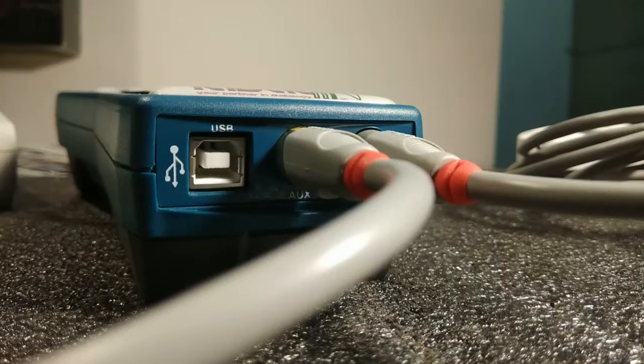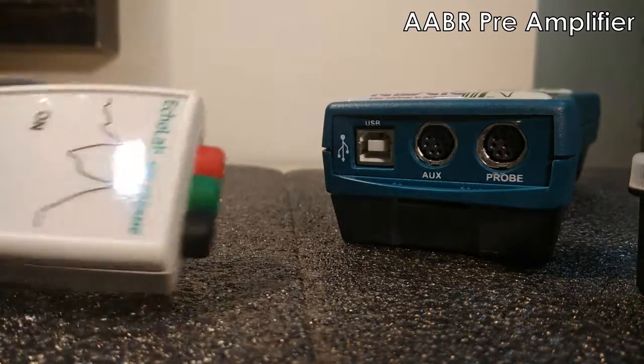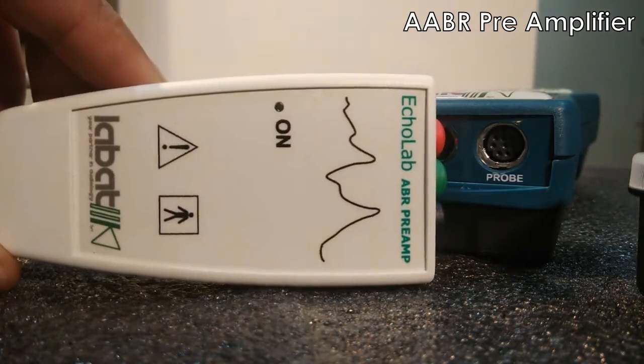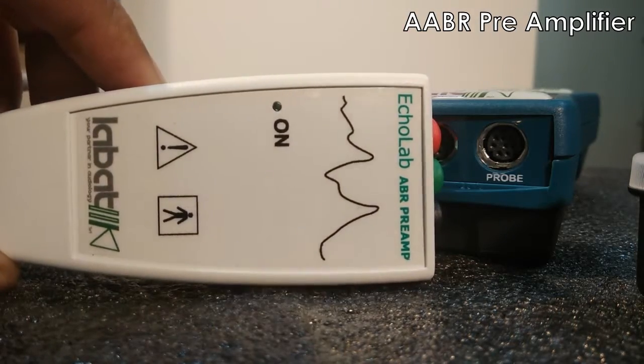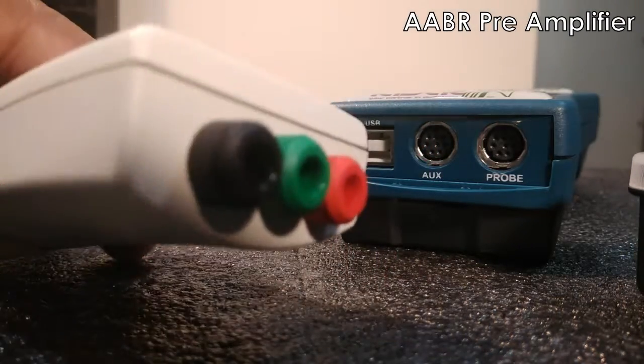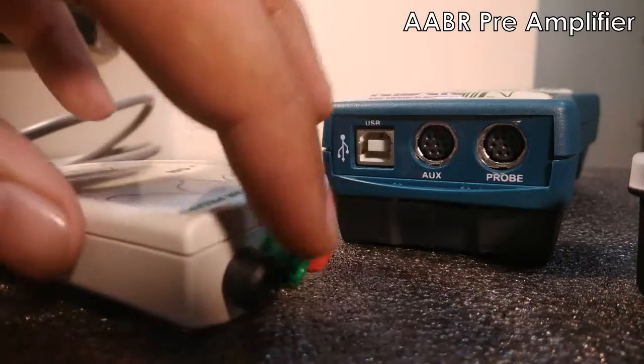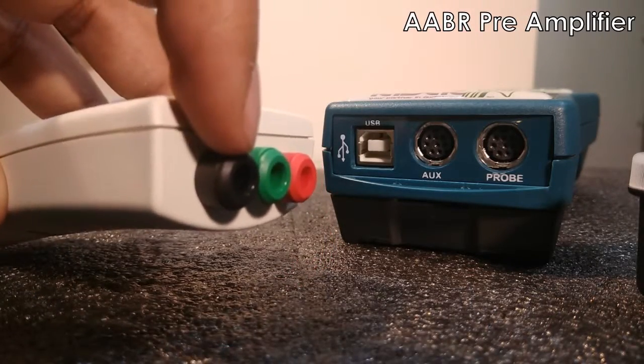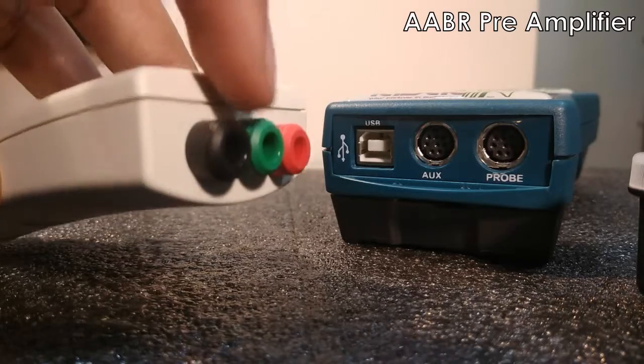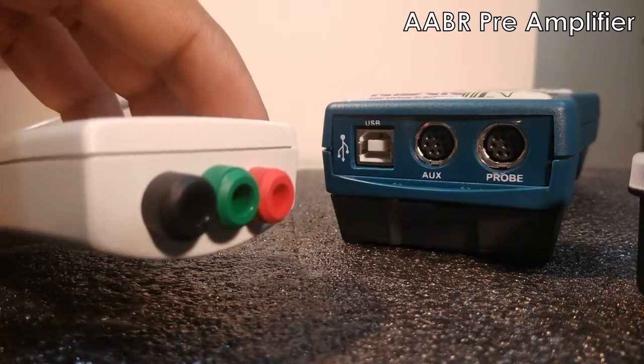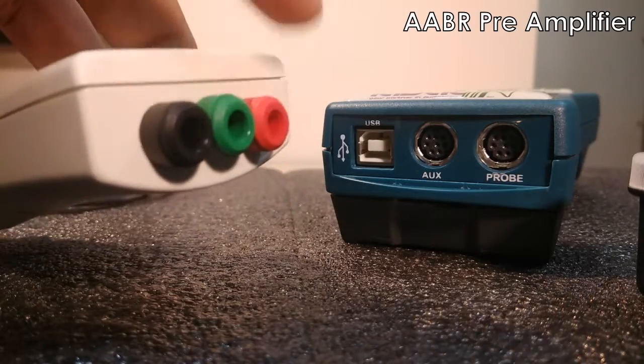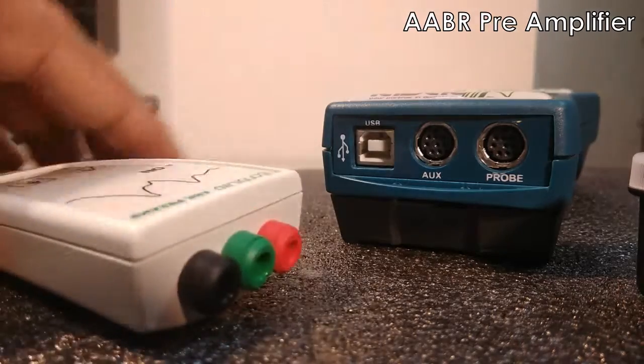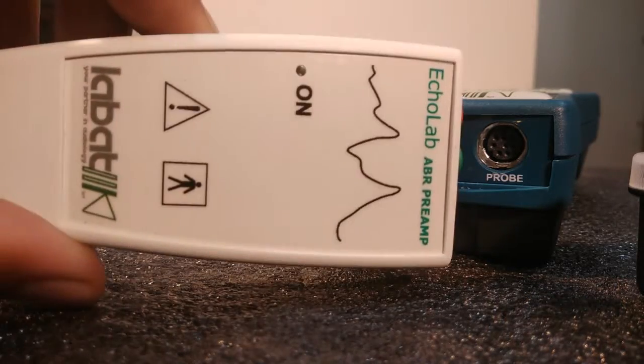Now I will show you the pre-amplifier. This is the pre-amplifier for screening AABR. You can see it's a single channel with three ports. The electrode from the black port will go to the test ear mastoid, from green will go to the non-test ear mastoid, and from the red will go to the upper forehead.